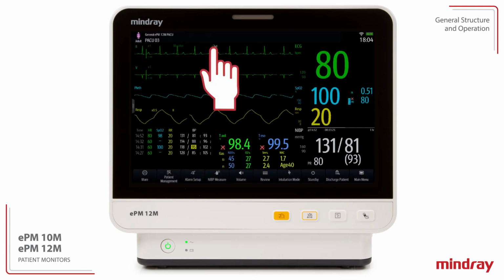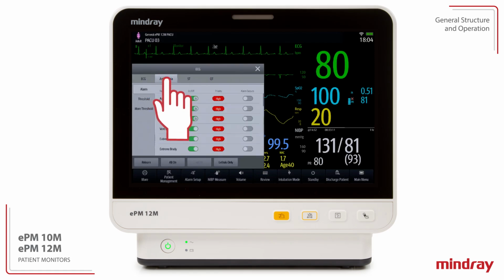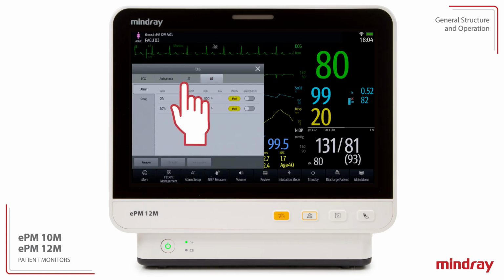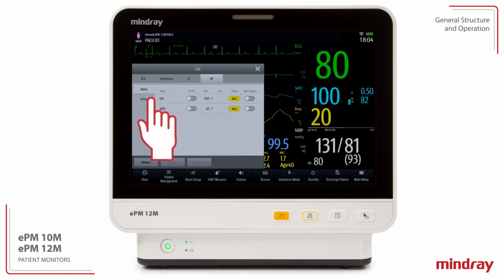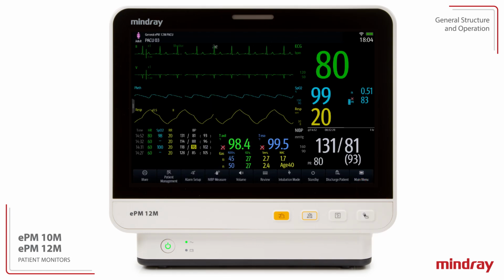For example, select the ECG waveform to open the ECG dialog. The ECG dialog contains tabs such as arrhythmia, ST, and QT at the top, and alarms and setup on the side. Operation buttons at the bottom include Relearn, Half Screen, and Full Screen. Select the X in the upper right corner of the heading to close the current dialog. The main menu quick key closes all dialogs and returns the display to the main screen.